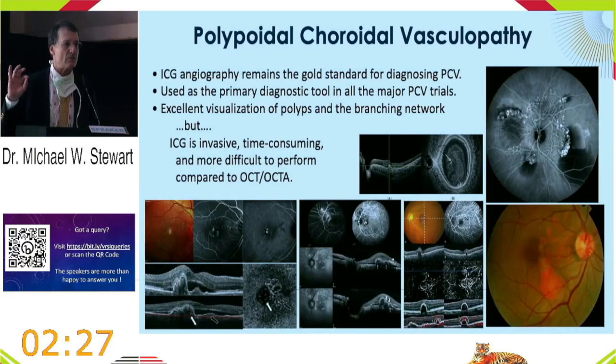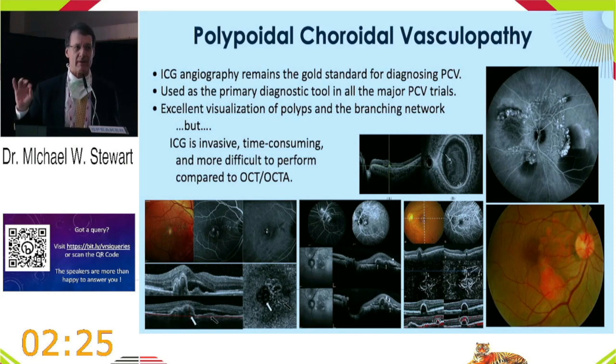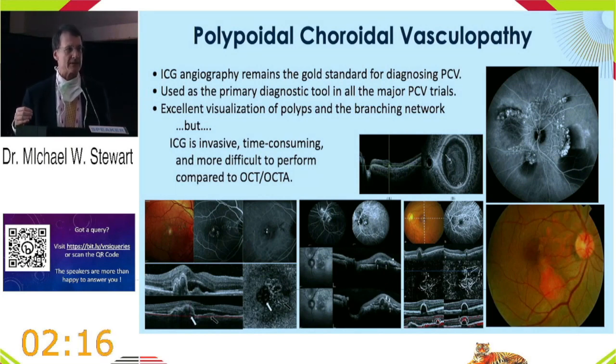But let's look at one specific variant of AMD, and that's polypoidal. We know that ICG angiography is the gold standard for polypoidal neovascularization.